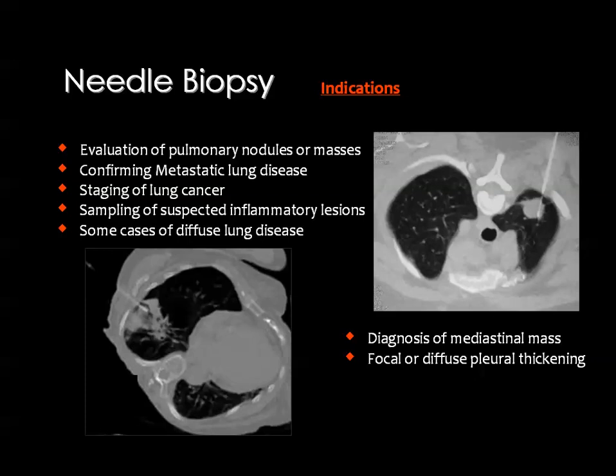Actually, I will handle here the issue of CT guided biopsy because this is the way I perform the interventional techniques myself, and I don't have enough experience in the ultrasound, and actually the MRI guided needle biopsy is not yet available in my country.